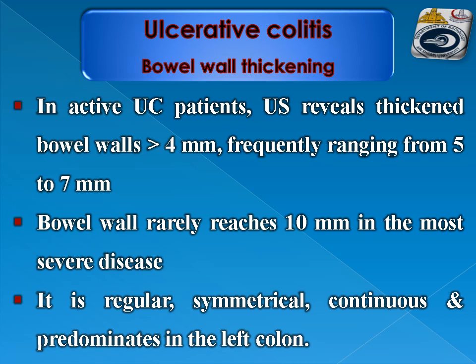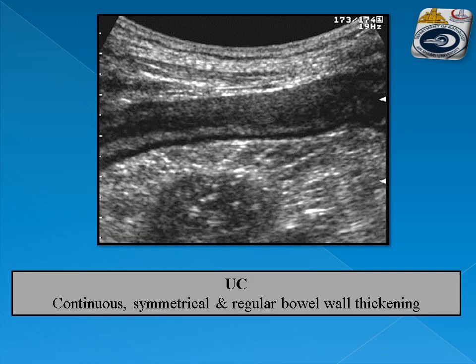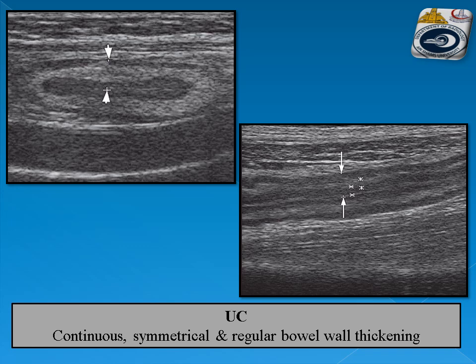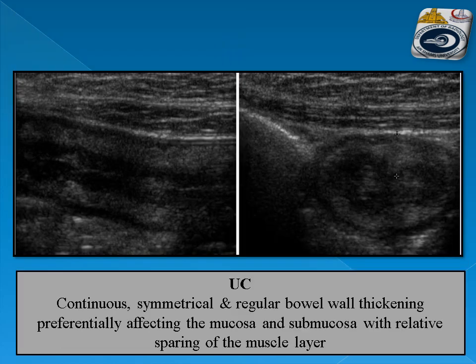Bowel wall thickening in active ulcerative colitis: ultrasound reveals thickened bowel wall usually more than 4 mm, frequently ranging between 5 and 7 mm, rarely reaching 10 mm in the most severe grades. It is regular, symmetrical, continuous, and predominates in the left colon. The thickening usually affects the submucosa and mucosa with sparing of the muscle layer. Examples show continuous symmetrical regular bowel wall thickening in transverse and longitudinal sections.